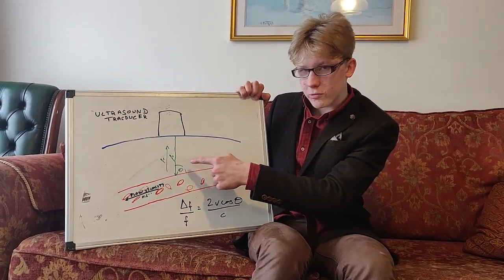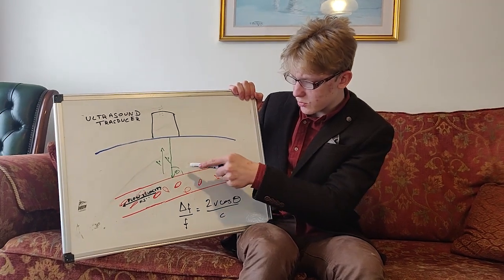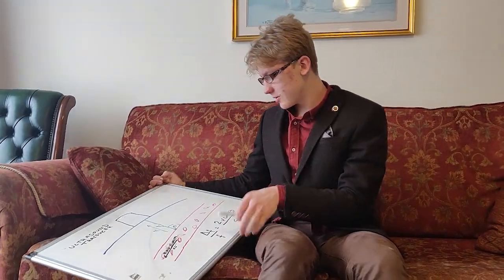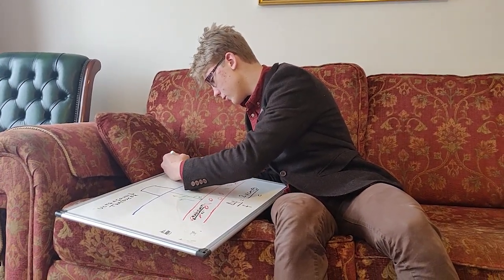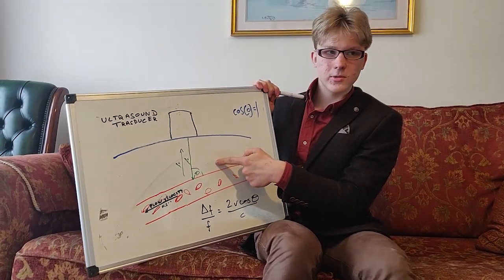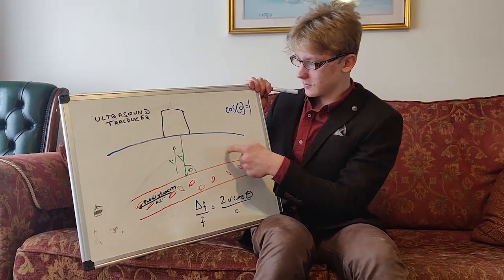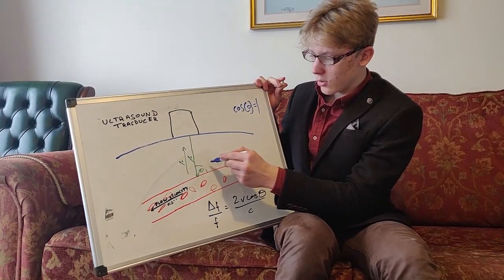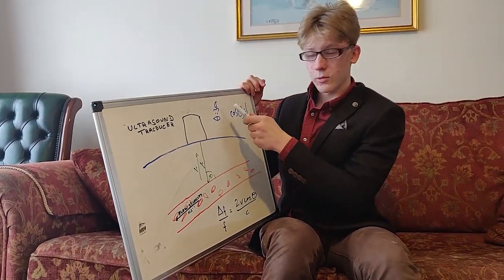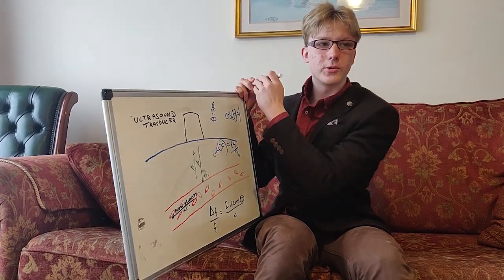And the way we do this is we want to reduce the angle theta, because when this is between 0 and 90, the smaller the angle theta, then the bigger this will be. Ideally, we'd have this be 0 degrees. So we'd have cos of 0 is 1. But obviously we can't put this at the same angle as the blood vessels, because this is inside their body, and that would not be good for their general constitution. So in practice we use an angle of theta about 30, which, as we all know, cos 30 is root 3 over 2. Thank you very much.